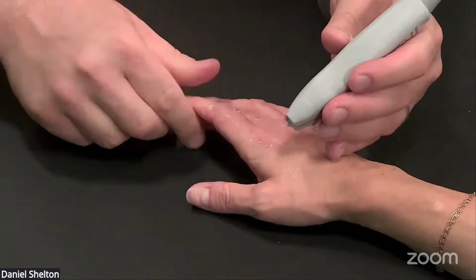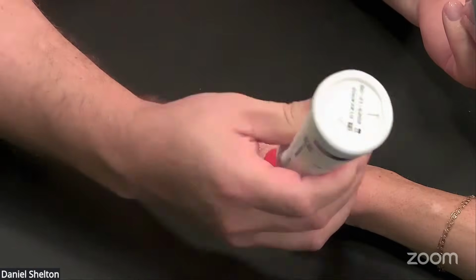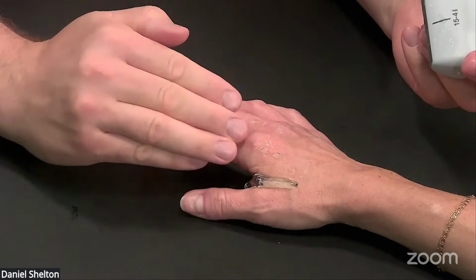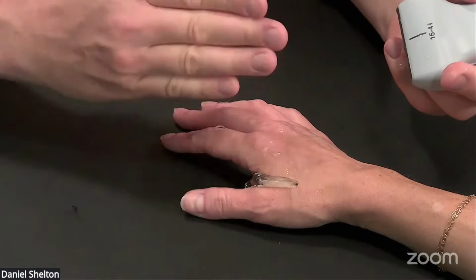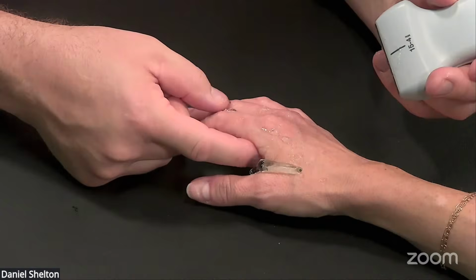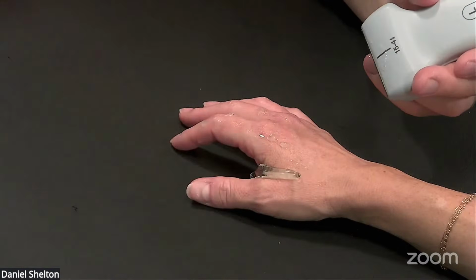Okay, now let's go to the thumb UCL, which I think most people are interested in. A few ways to get at this is just to understand how ulnar we're talking when we're talking about ulnar collateral ligament. We're not just talking about slightly ulnar to dorsal. It's extremely coronal, this slice that we're going to take. And remember, the aponeurosis is coming from the adductor pollicis from the palm, coming right under my gel there to the top of the knuckle and seeing it drape across the top.